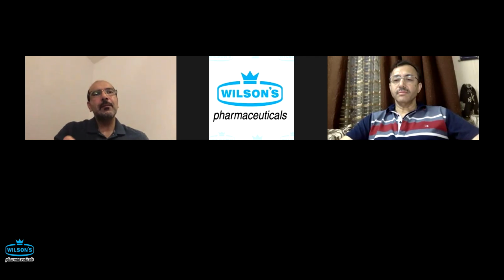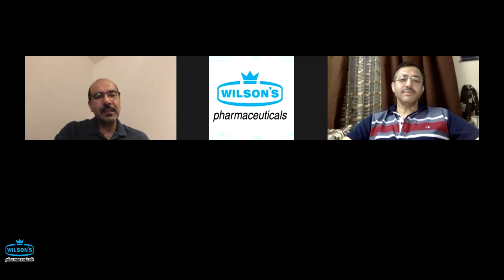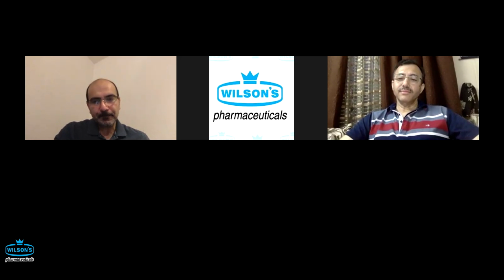So it's really a matter of achieving competency based on the task at hand. Can this provider identify the pancreatic duct all the way from the papilla to the tail of the pancreas? Can this provider sample a pancreatic mass? What is their diagnostic yield for a mass? A pancreatic mass that's 2 centimeters is very different compared to a 5 millimeter lymph node. That's going to be more challenging.